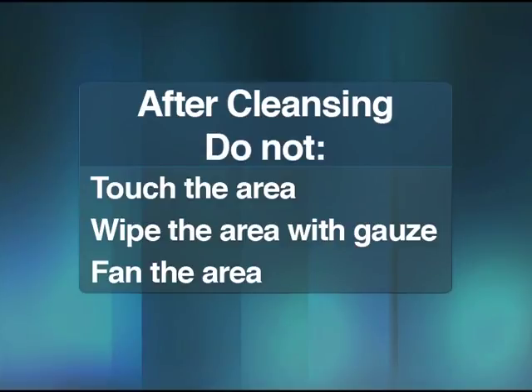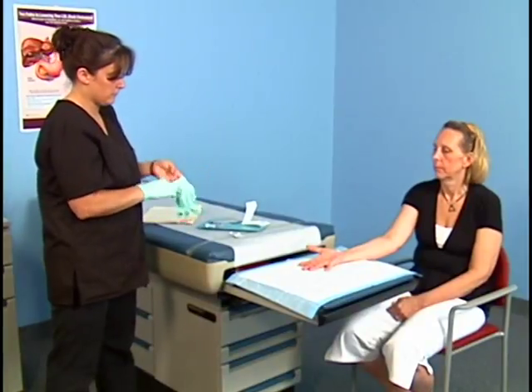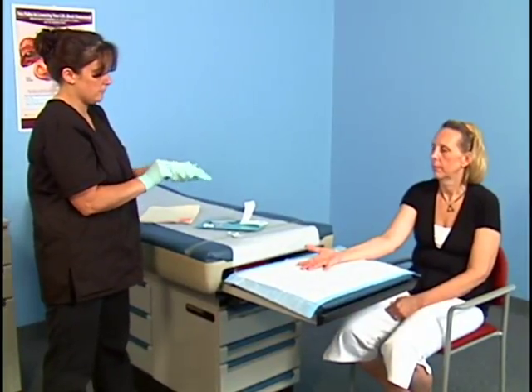Do not wipe the area with gauze or fan the area with your hand. All of these actions can cause contamination, and the cleansing process has to be repeated. Apply your gloves as a barrier precaution against blood-borne pathogens.